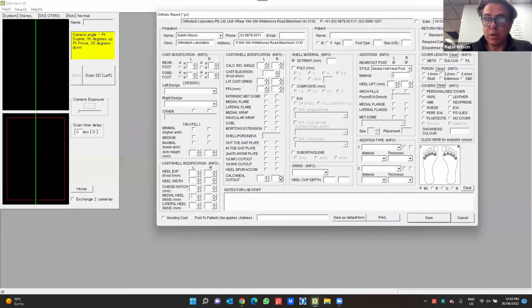You'll notice there's also scrolling wheels now going up and down. So that just enables you to move it up and down. You can still type in there, so you can still put digits in there. They do tap out at a certain level. Okay, so this one's at 40 mil, just because a 40 mil calcaneal cutout almost takes out the full plantar surface of the heel.